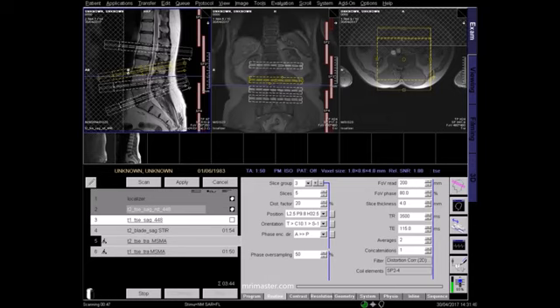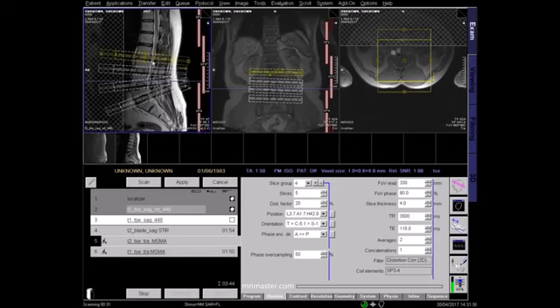You should also cover any other pathology that's seen in the vertebra or spinal canal by adding slices. Scroll through the image to ensure slices are sufficient to cover each intervertebral disc from top to bottom. A group of 5 slices is usually sufficient.